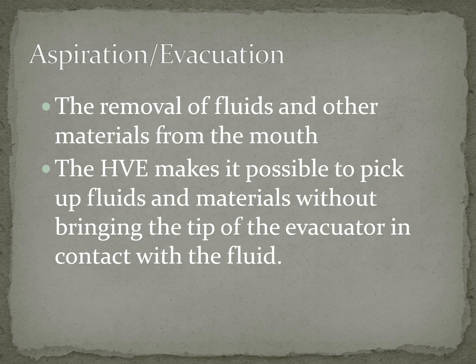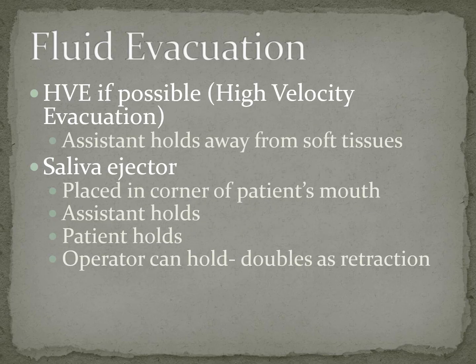So the HVE is going to make it possible to pick up fluids. It's going to pick up materials without bringing the tip of that evacuator into contact with the fluid. Okay, so the high vac is very powerful. You have to be careful that we don't get attached to tissue because it can do some tissue damage.